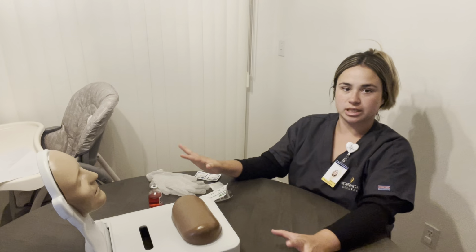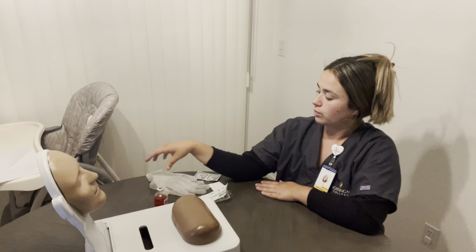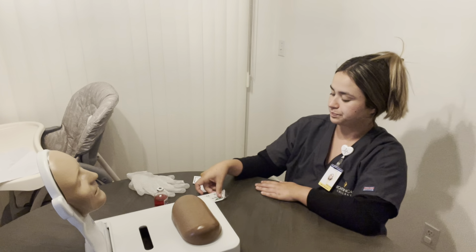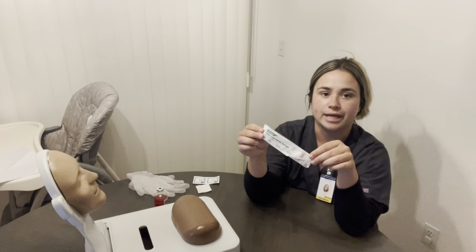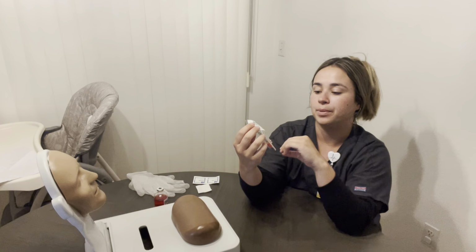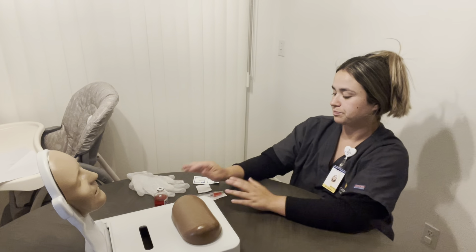So this is my workspace today. We have our patient, we have our medication, a pair of clean gloves, our gauze, alcohol swabs, and our syringe. Normally the order calls for a 22 to 25 gauge with 1 to 1.5 inch needle, but I don't have that in my kit, so I'm just going to be using the tuberculin safety syringe today.